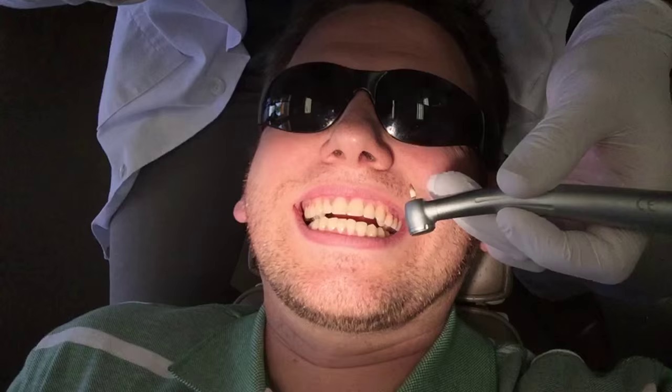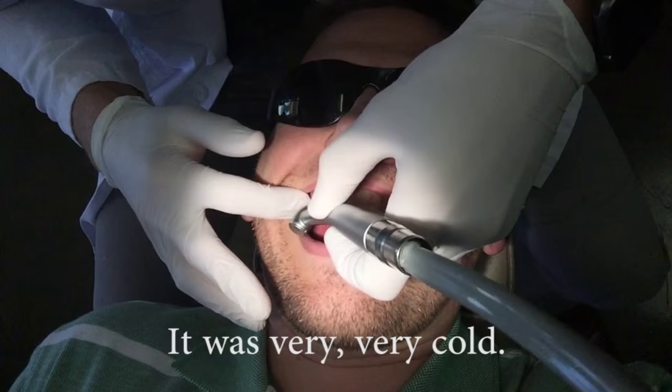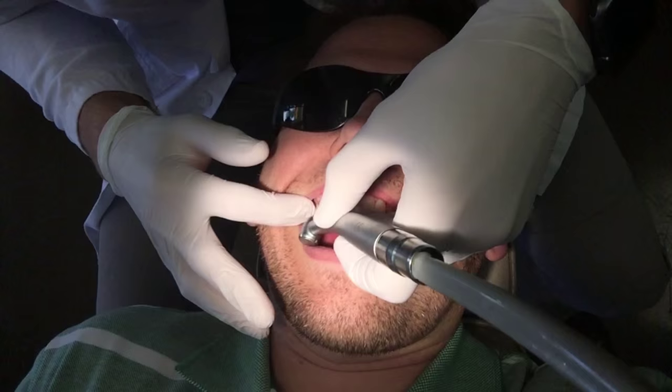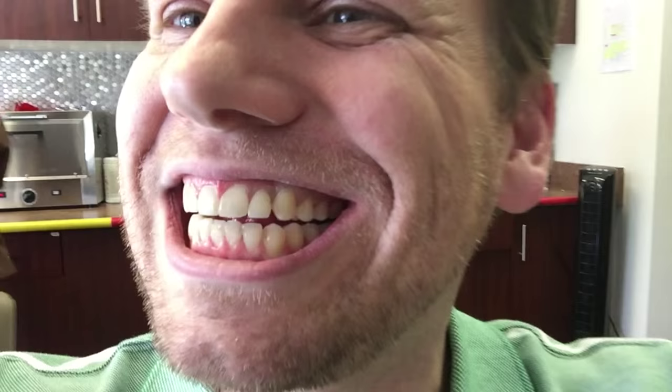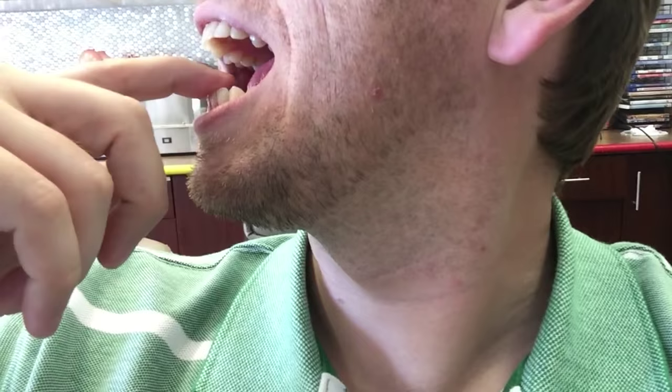The orthodontist says to raise my hand if I feel any sensitivity — it's going to be cold from the air. They're going to smooth off my edges just a little bit, on the bottom and the top.